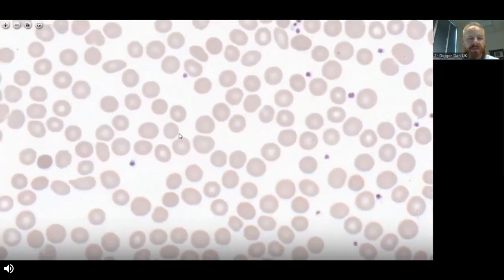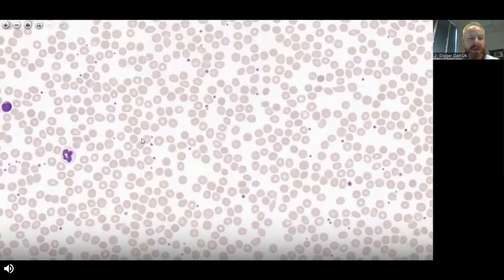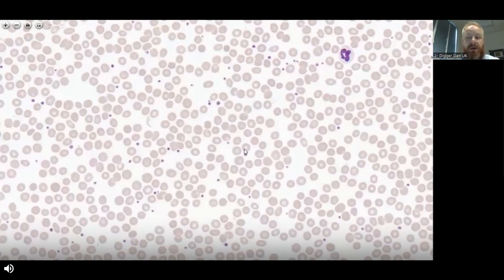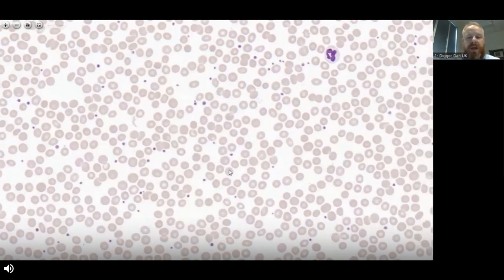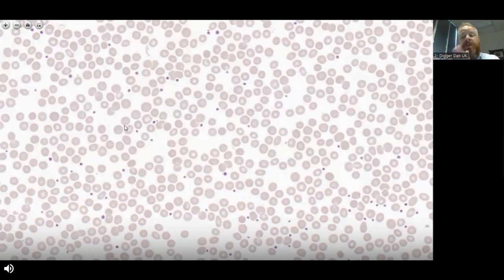Looking around this normal film, we can see how the platelets appear with that small variation in size. Analyzers would show maybe a slightly higher PDW — platelet distribution width — but really nothing stands out as particularly small, particularly large, or particularly discolored. I use those three focal topics because that is what we're going to be looking at: small platelets, large platelets, and discolored platelets.